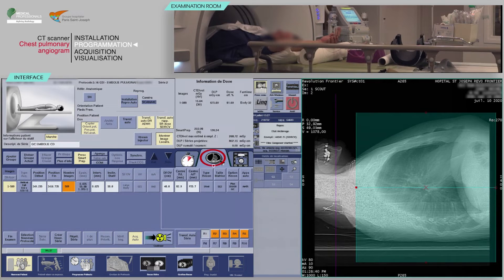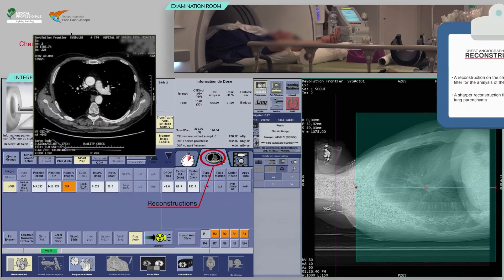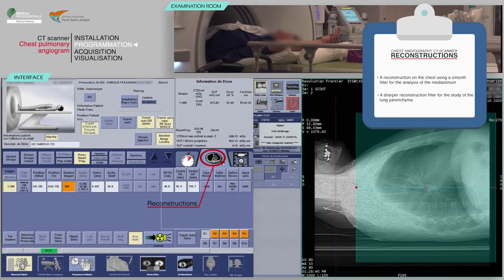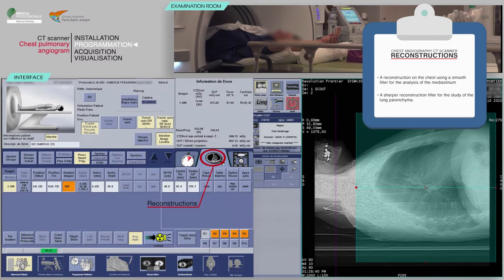Next, check the reconstruction boxes. For the acquisition of the chest angiography, there should be at least one reconstruction of the chest using a smooth filter for the analysis of the mediastinum, and a sharper reconstruction filter for the study of the lung parenchyma.